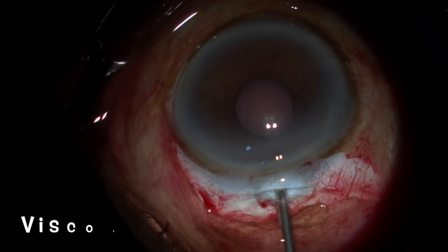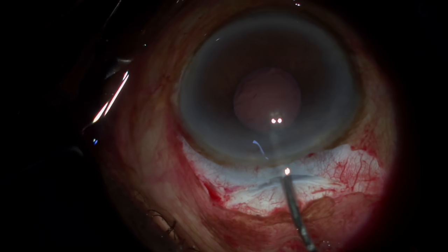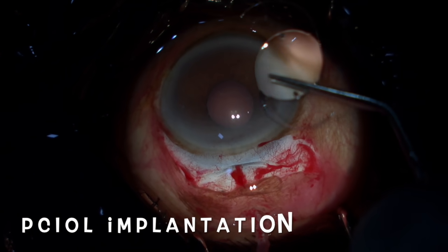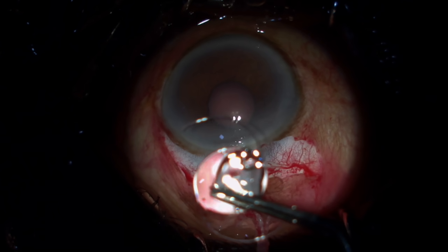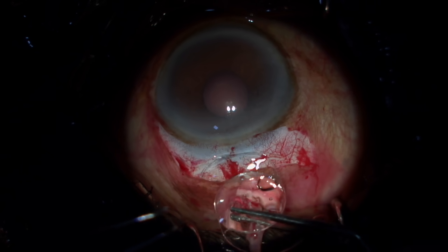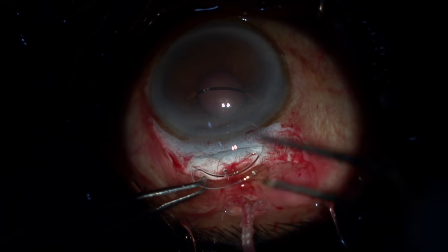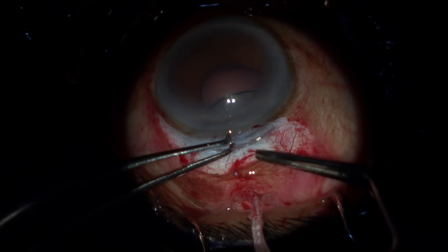Inject sufficient visco to make sure that you inflate the bag first and then the anterior chamber. Here we are using a single piece PMMA rigid lens. Always hold just above the center part of the lens — don't give too much pressure or it will crack. I use two instruments and make sure that the leading haptic goes in first. Once the leading haptic is inside, I visualize it going under the iris and into the bag by lifting the trailing haptic up.